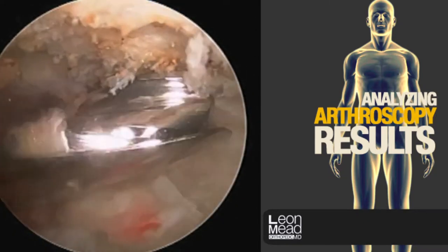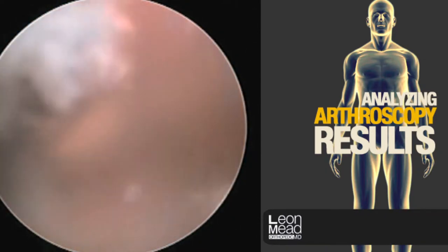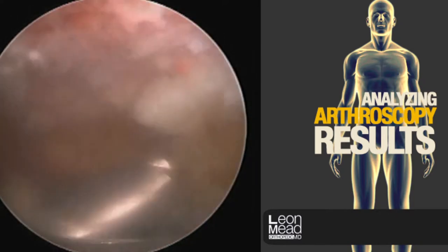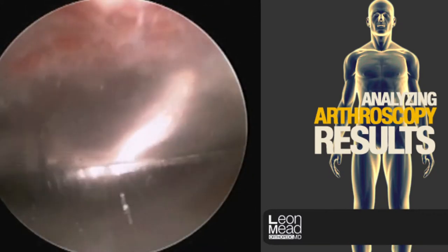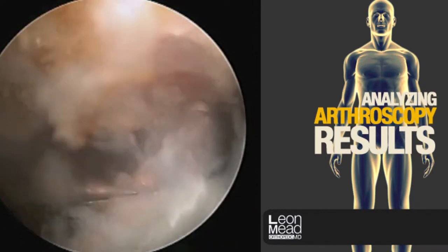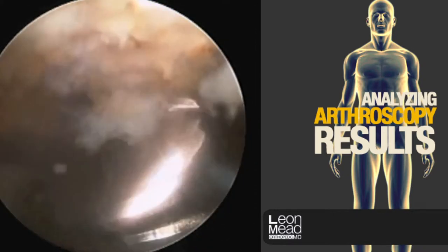Ideally, the undersurface of this bone is smooth and flat. This is done in a fluid medium, so it looks like we're working underwater. There's a pump that keeps the tissue from collapsing in on our viewing screen. The tissue does become waterlogged with time, and we do have to make an effort to clean it out from time to time so we can visualize things well.